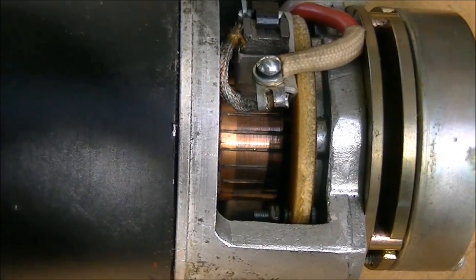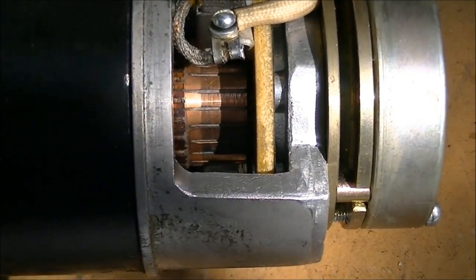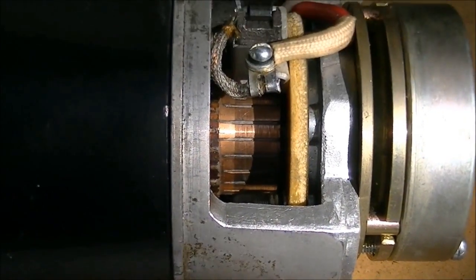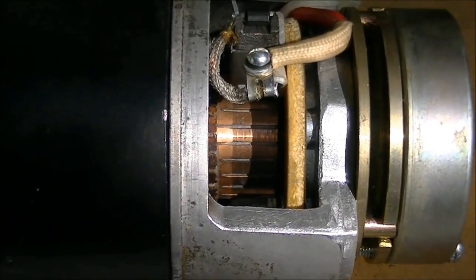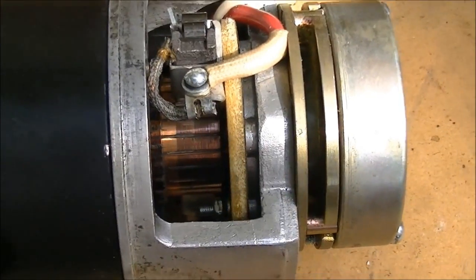I'm also cleaning the brushes and we'll see what happens. It may be difficult to tell the difference in this video — I can tell myself since I can see the real thing — but it does look better than when I started. Here's a q-tip and a rag used to wipe off the brushes, and there's the q-tip with all the crud I took off the commutator.